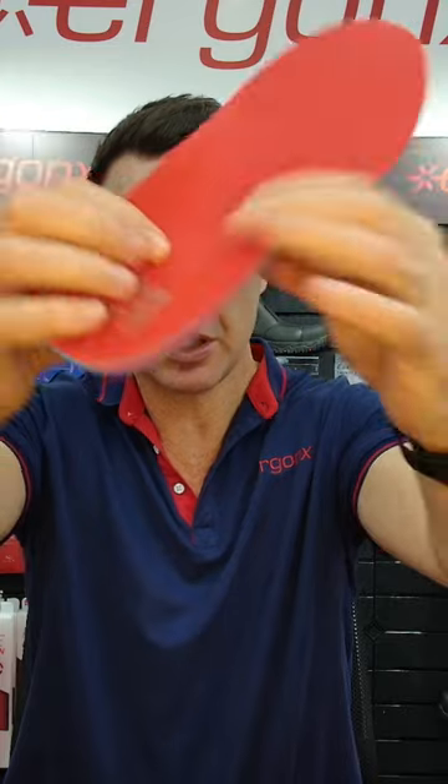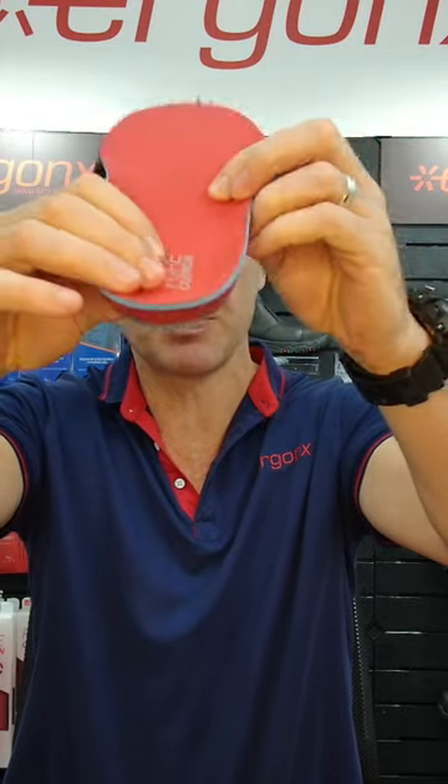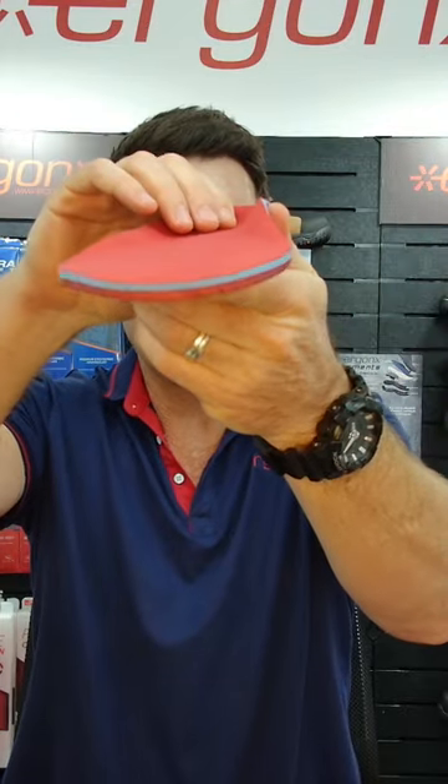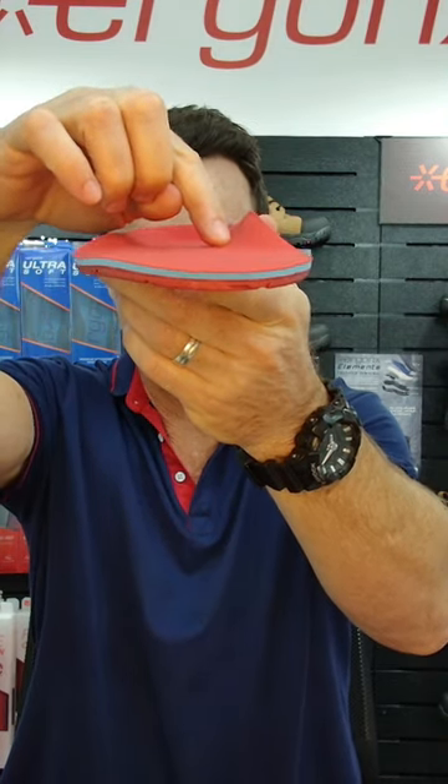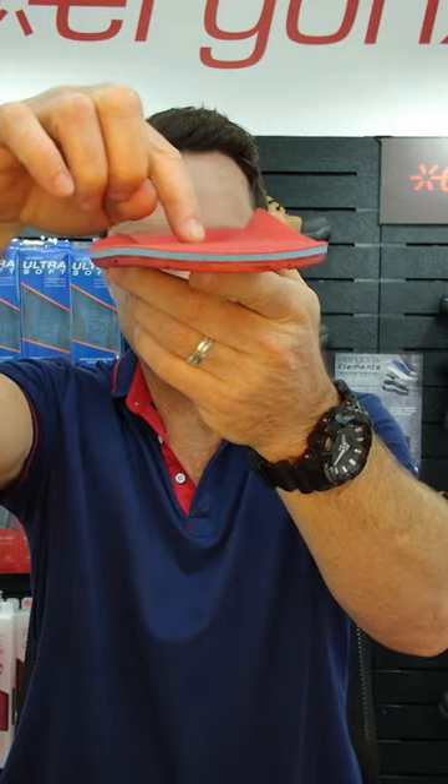If we take a look at this orthotic inner sole, the reason why we use this one is because if we take a look straight down the length of the orthotic inner sole, you'll see that the arch section finishes just to the inside of the foot, so it doesn't actually pack up that arch.